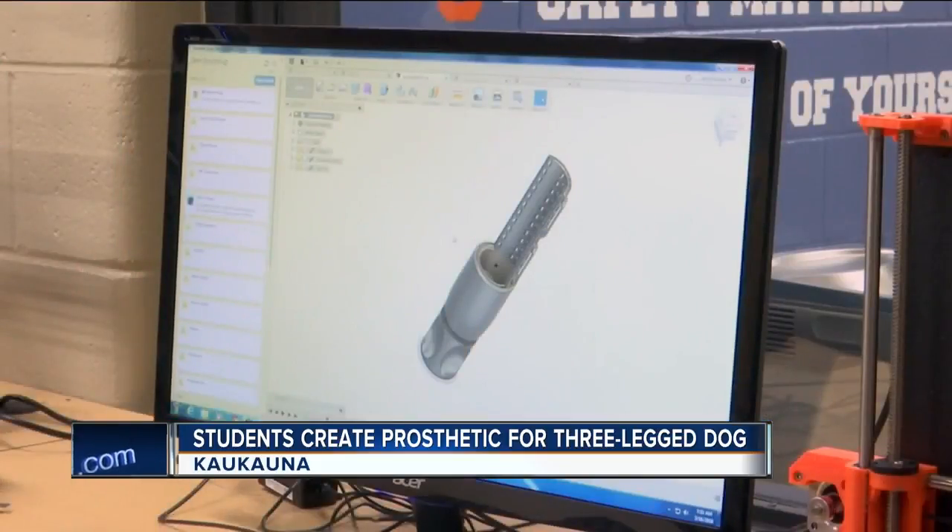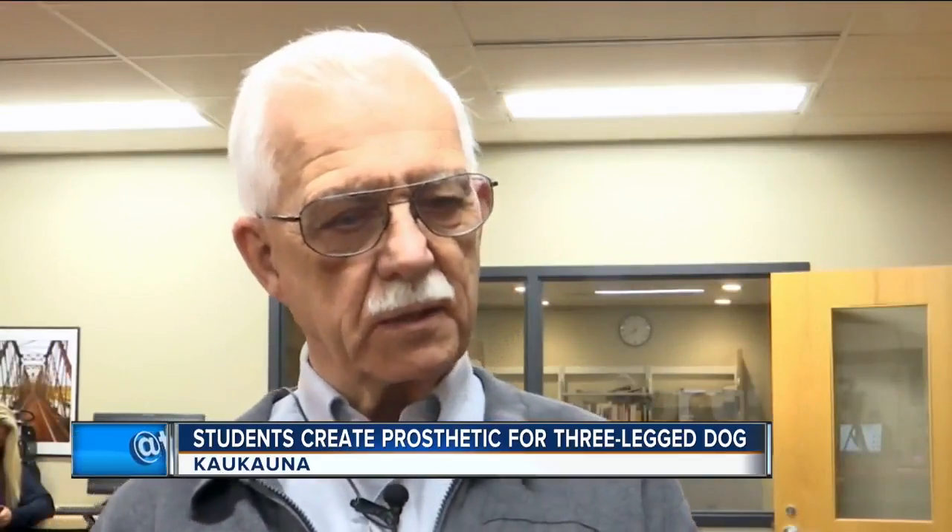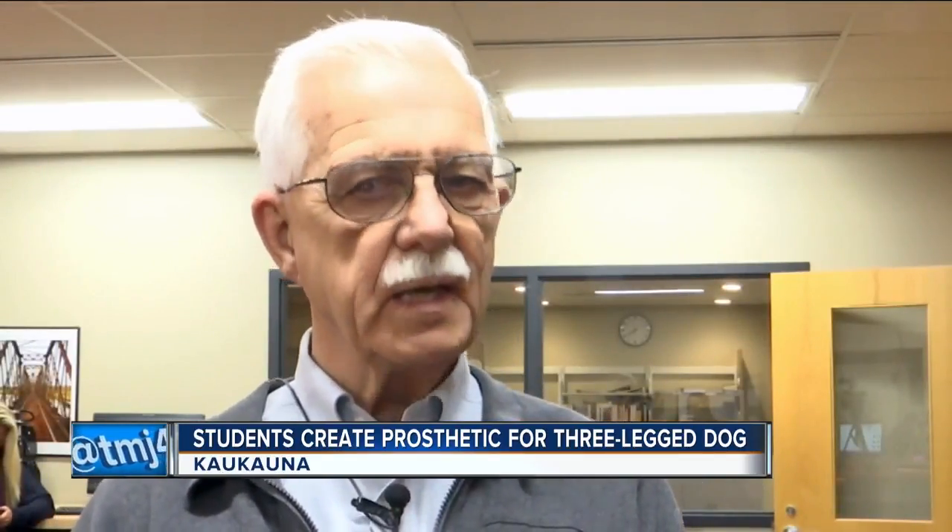Students designed and built the prosthetic with a 3D printer. It's actually a little string of plastic. The 3D printer melts the plastic, and it works like a CNC machine — it lays down a layer, then moves up a layer.